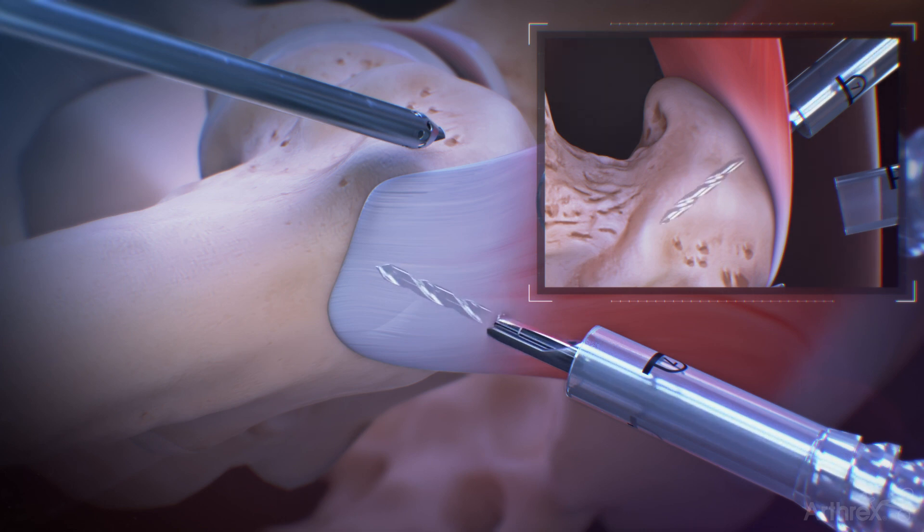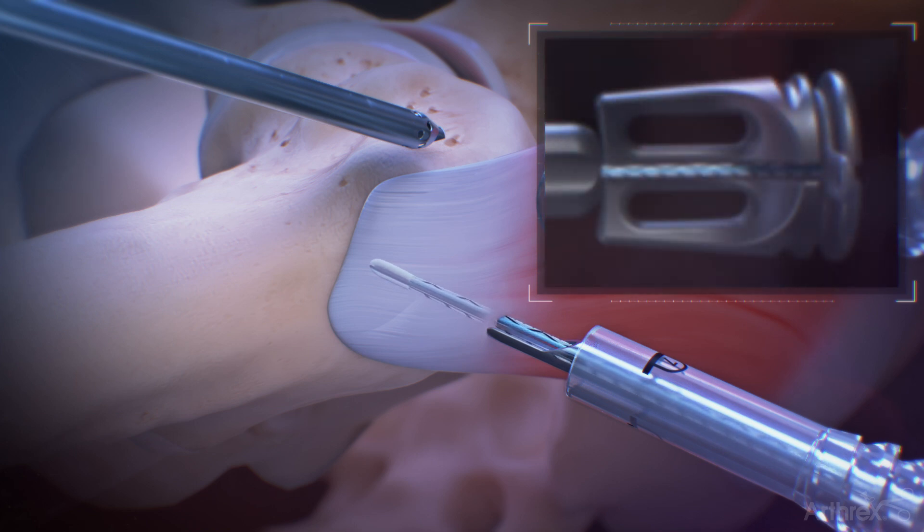Prepare a 2.6 mm bone socket by drilling until the collar of the drill impacts the back of the drill guide. Insert the anchor through the drill guide with gentle impaction until the inserter handle meets the drill guide with a positive stop.